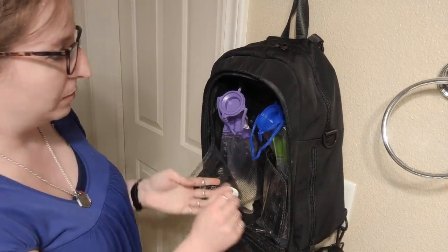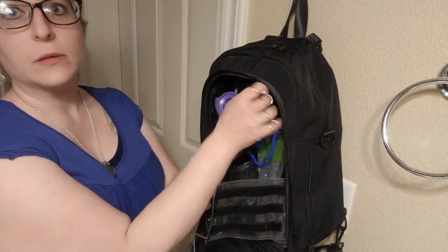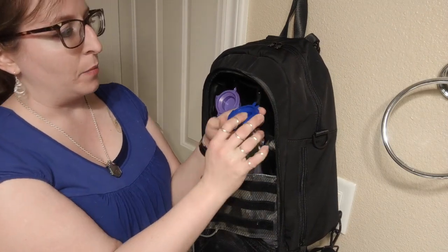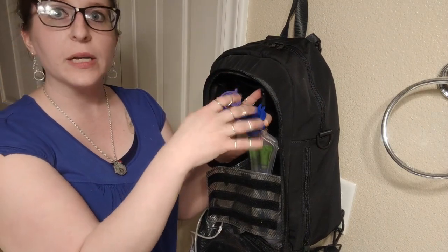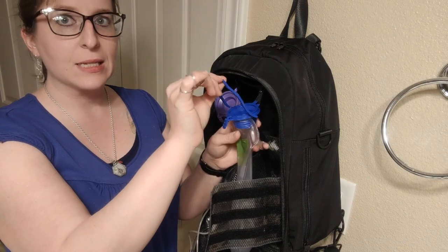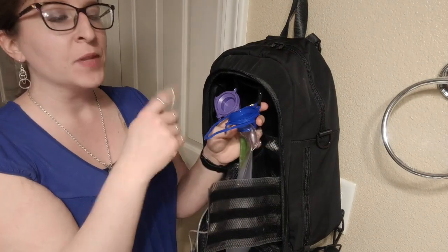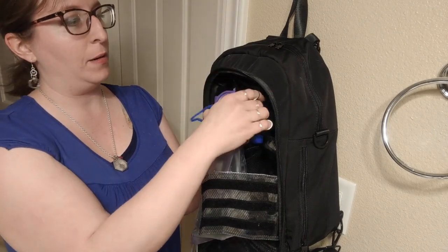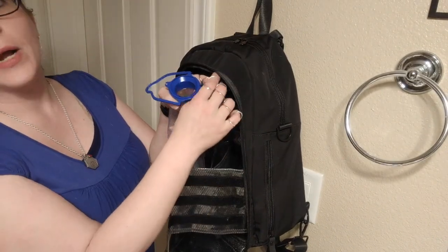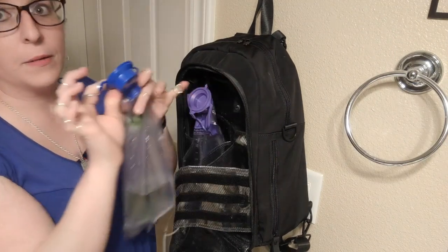And these are holding the bags in place. So there's a little snap right here. A lot of times, if you see photos of the other pumps set up in here, they put the snap through this. If you put the snap through this, the bag sags too low. It doesn't pull it up high enough. So what I did instead is I went ahead and opened up that, and then I loop it through. I don't know if you can see that very well or not. But I loop it through this little part right here. So then unsnap that. That's free.